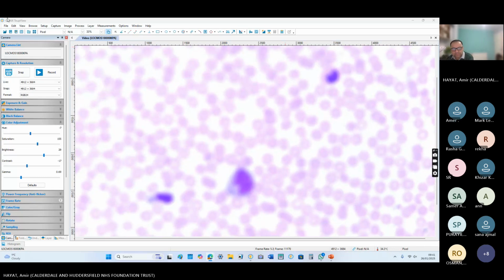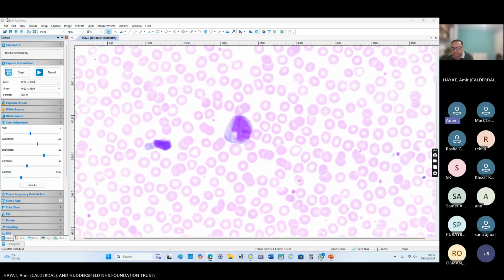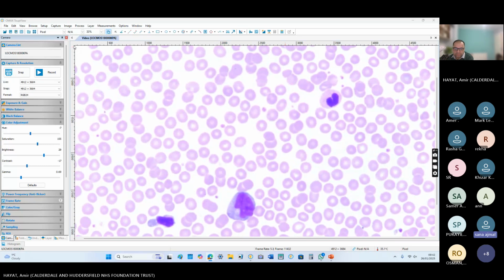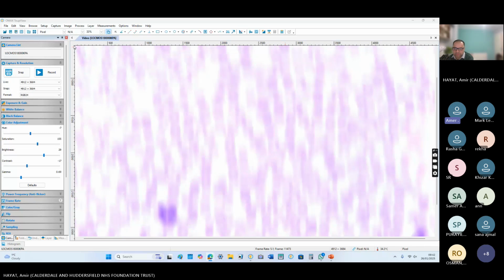She is 23 years old. She has fever and cervical lymphadenopathy. These cells are all basophilic. One of the colleagues informed me that these are reactive lymphocytes, infectious mononucleosis cells. CLL cells are not like this, and you will not expect CLL in a 23-year-old. Follicular lymphoma cells have their own morphology with a cleft in the center. There wasn't so much clear scalloping of the red cells around them. You have seen many cells with very clear scalloping, and these cells are basophilic with a lot of cytoplasm as well.